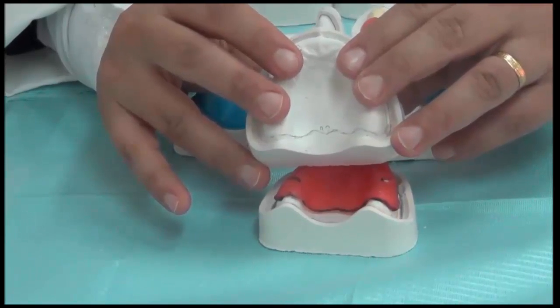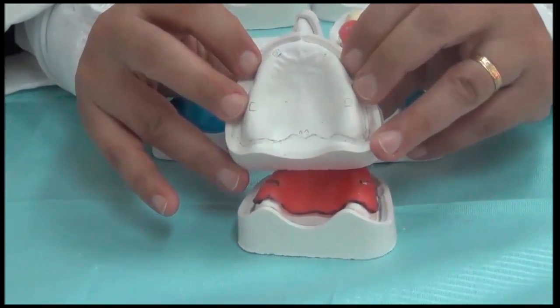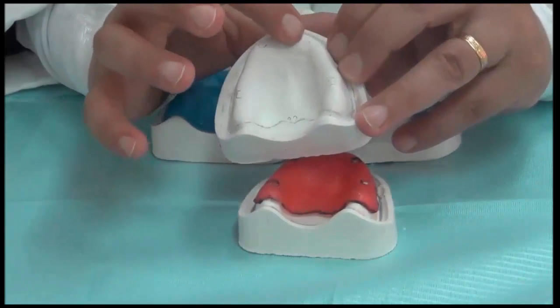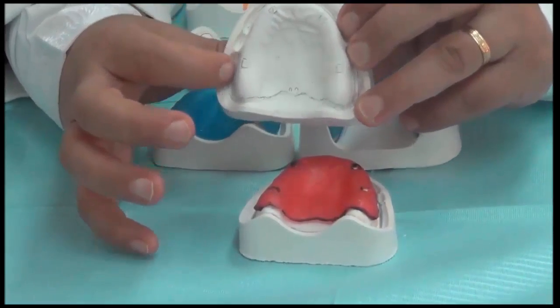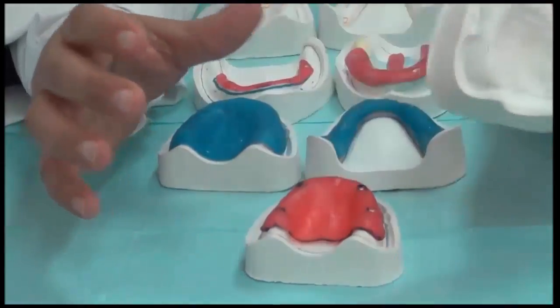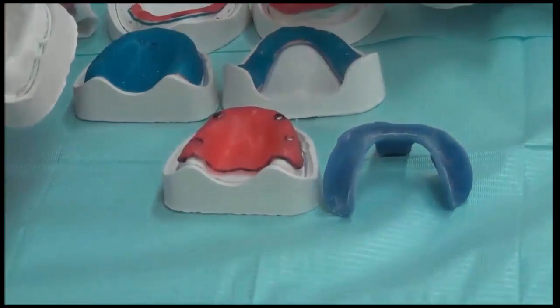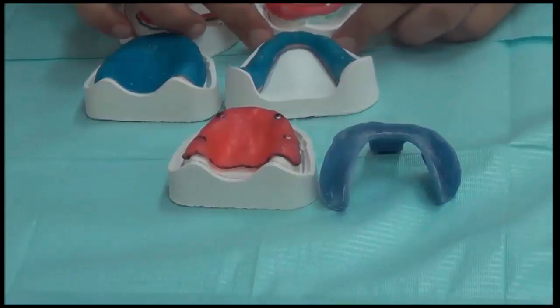This extra compressibility means the denture will sink more into the tissue and once more exert pressure on areas that we should have been relieving. The denture could also go through the sulci and cause trauma to the patient later on. So a case where no relief is present or full relief is present are both, in the long term, hazardous to the patient and might cause harm. So for our purpose, we choose to do partial relief.